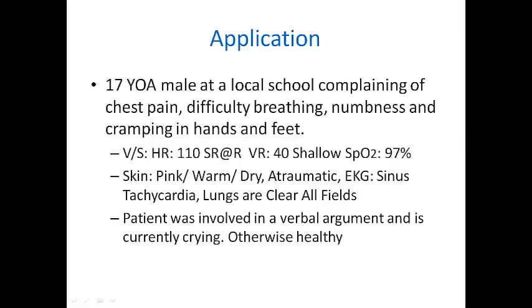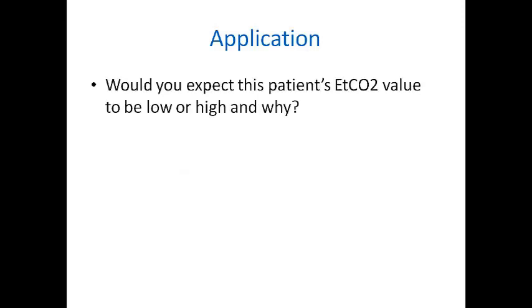Before we finish, let's try 2 cases and use this to bring some of the things we've learned into application. Presently, we have a 17-year-old male at a local school who's complaining of chest pain, difficulty breathing, numbness, and cramping. The patient is noted to have been involved in a verbal argument, currently crying, but is otherwise healthy. Would you expect this patient's end-tidal CO2 value to be low or high, and why?